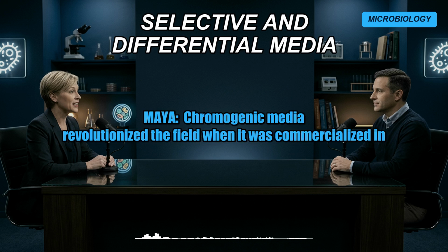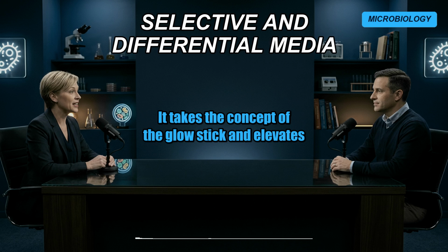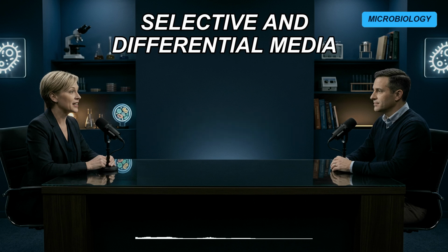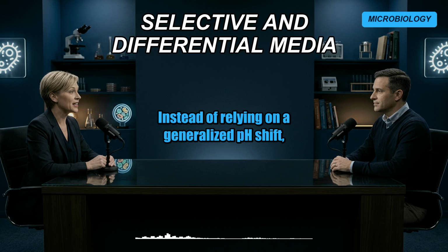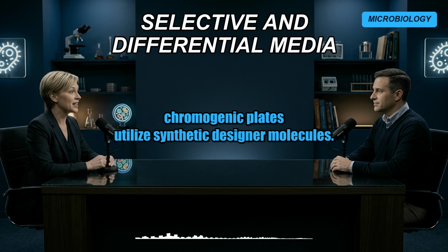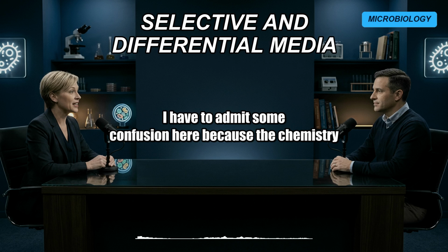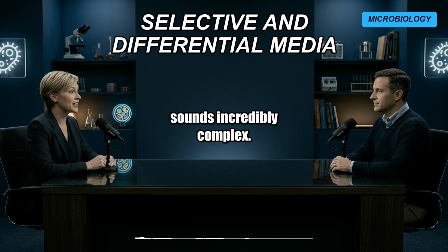Chromogenic media revolutionized the field when it was commercialized in the 1990s by a scientist named Elaine Rambach. It takes the concept of the glow stick and elevates it to a level of incredible precision. Instead of relying on a generalized pH shift, which can sometimes blur or bleed into neighboring colonies, chromogenic plates utilize synthetic designer molecules. Okay, I have to admit some confusion here because the chemistry sounds incredibly complex.